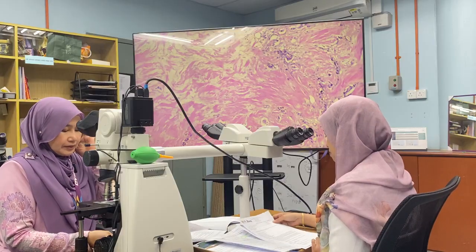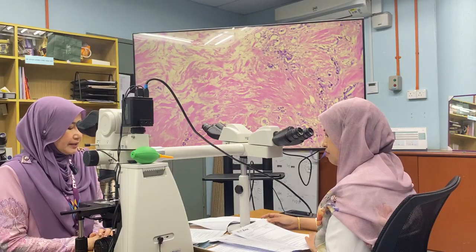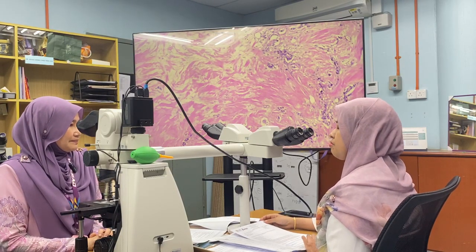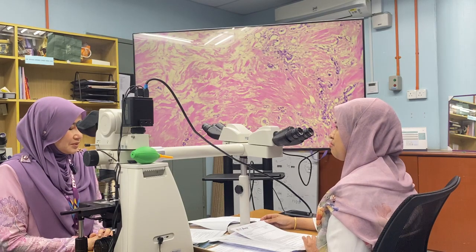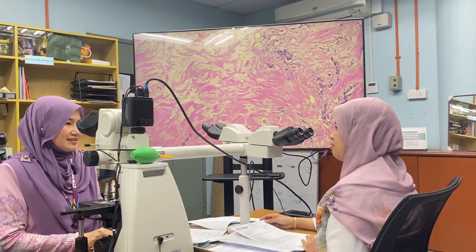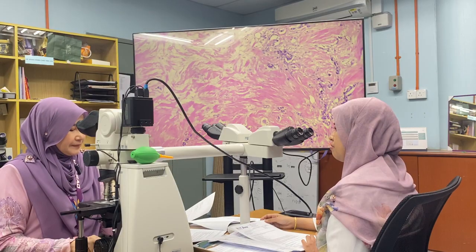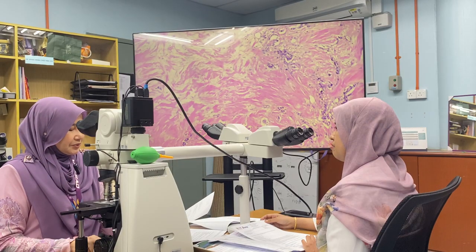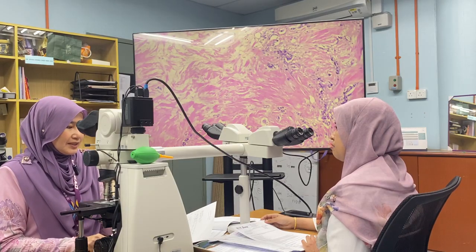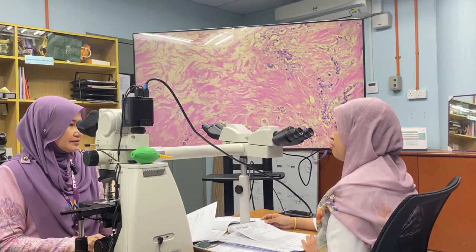Before I proceed with another question, thank you for picking up this case. I think you know that a post-neoadjuvant chemotherapy specimen is quite challenging for us to evaluate. First of all, why do you think they proceeded with neoadjuvant chemotherapy before surgery?